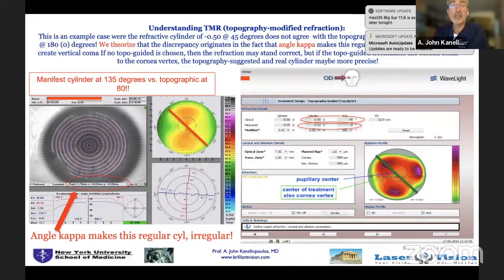And all platforms have reached the point of giving good refractive data. Today's lasers are all very good at giving what we call a 20/20 happy patient, a refractive surgery patient that wants not to wear glasses. Here we're talking about how not just to get rid of glasses and contact lenses, but to improve the eye's visual ability.